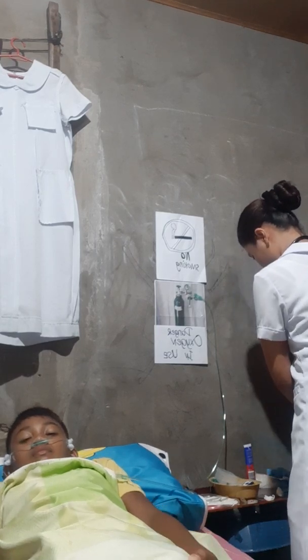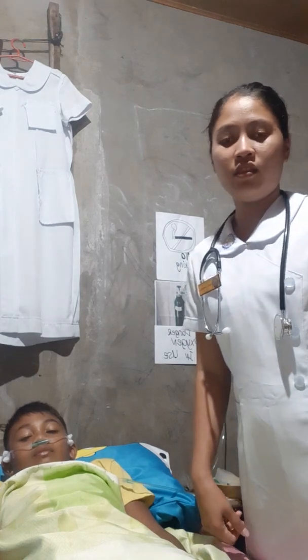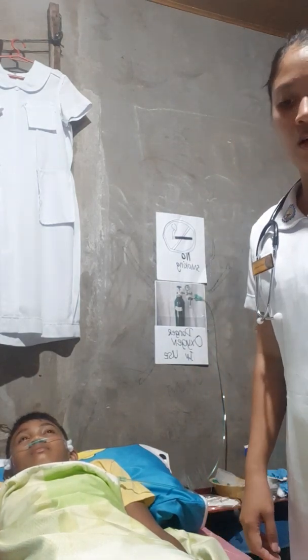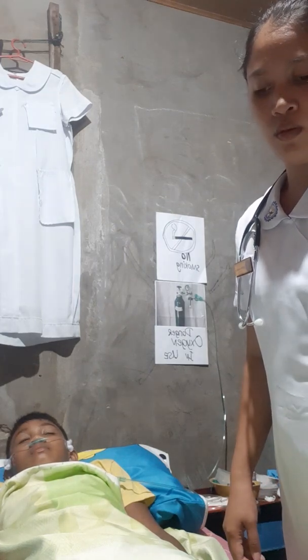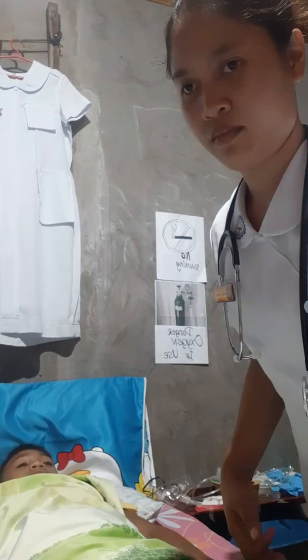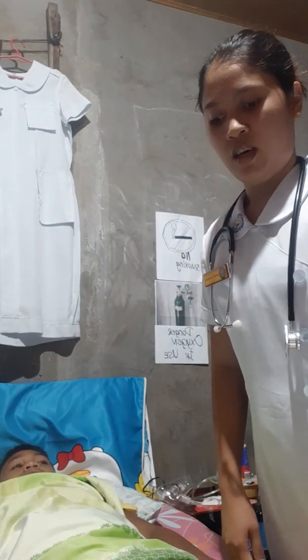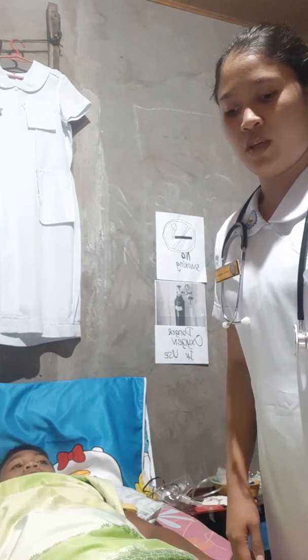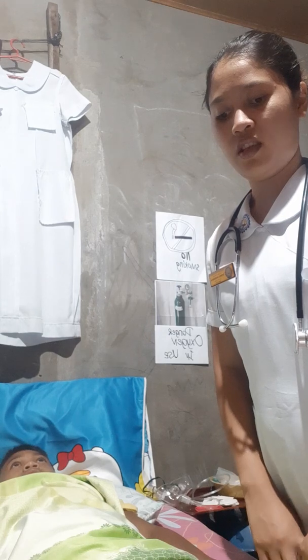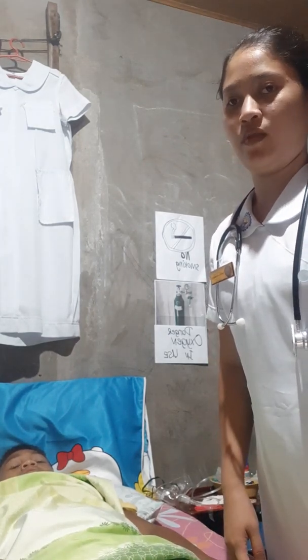Our next procedure is oxygen therapy using face mask. The purpose of this is to provide moderate oxygen support and a higher concentration of oxygen and humidity than the cannula provides.